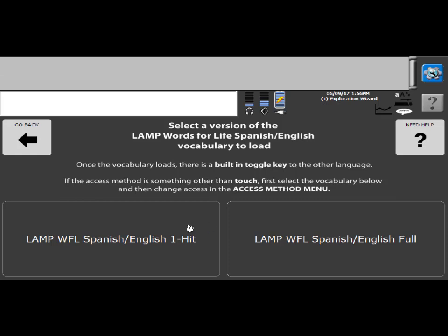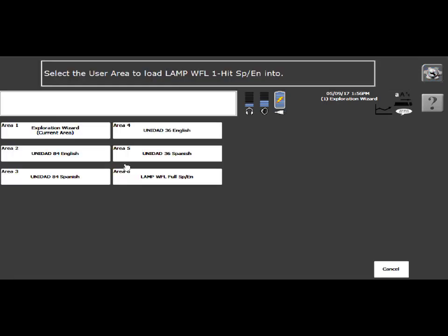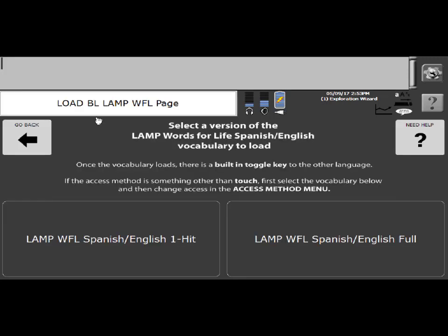In this instance, I'm going to load in one-hit and it's going to prompt me. You'll see, in any device, there are six active user areas and they are preset. So we have the Exploration Wizard, UNIDAD 84 in English and Spanish, UNIDAD 36 in English and Spanish, and then Lamp Words for Life full is already loaded in. So we need to actually load in the one-hit program. And I'm going to do that in area five. Here it says select the user area to load in Lamp Words for Life one-hit. So I'm going to pick area five.